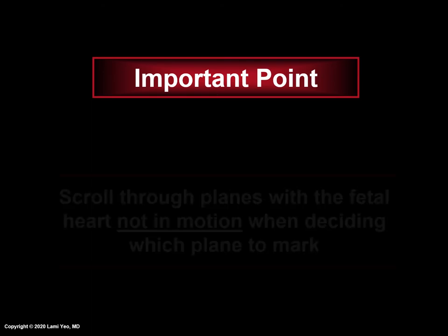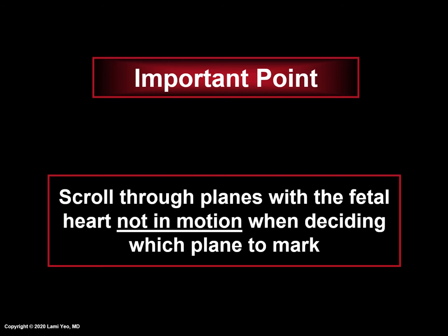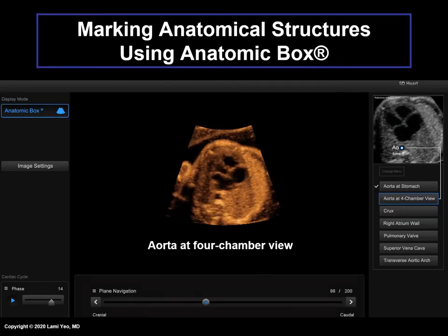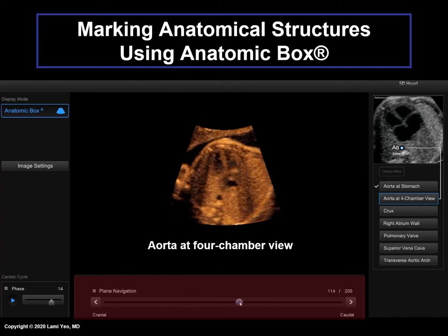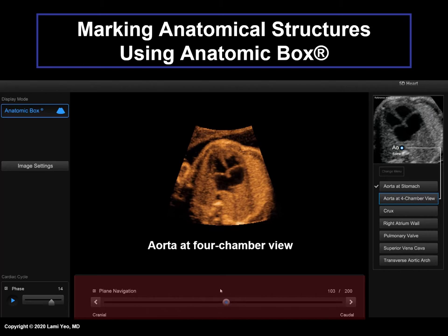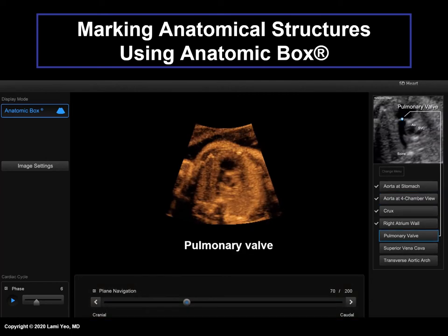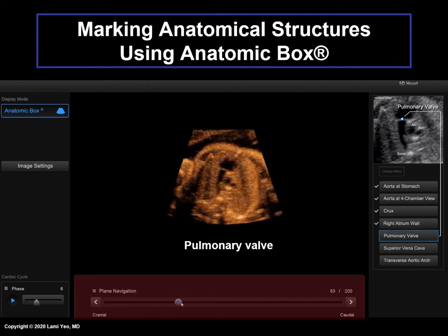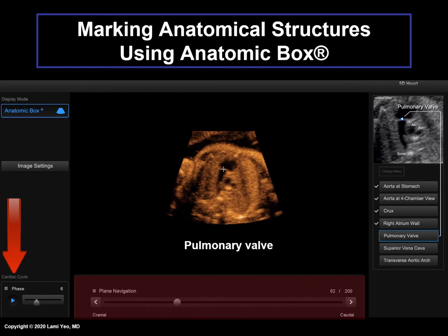An important point is that we strongly recommend scrolling through the planes with the fetal heart not in motion when deciding which plane to mark. Here, the user is scrolling through the planes to determine which is the best plane to mark the aorta at the level of the four-chamber view, and the heart is not in motion. This is strongly recommended because all marking guidelines have been developed based on the fetal heart not in motion. It is also acceptable to momentarily pump the fetal heart to identify the pulmonary valve before marking.